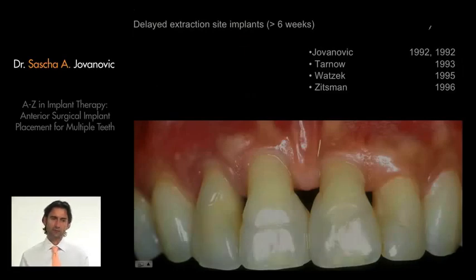Other areas have to be looked at always in the same fashion. So when we have another patient like here, this patient was middle-aged, about 40, but had periodontal disease in the history.